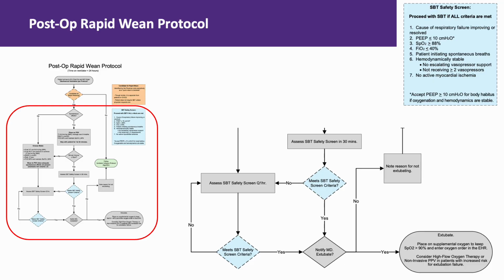You're not waiting until tomorrow. You're not waiting for rounds. You're reassessing hourly because these patients are expected to wean quickly. Every hour you wait is an hour of unnecessary ventilation.